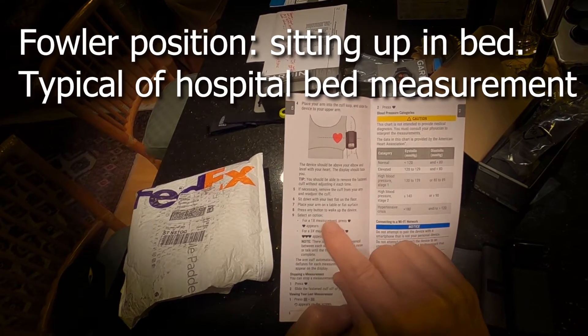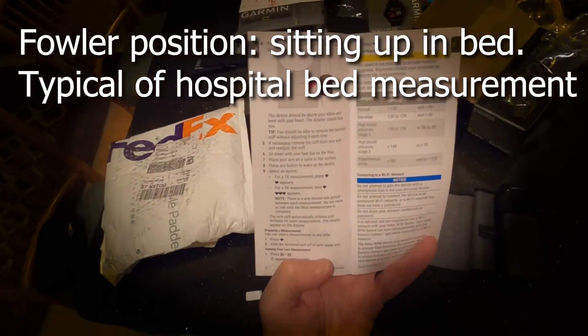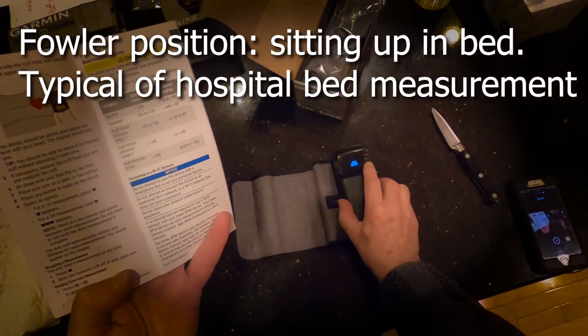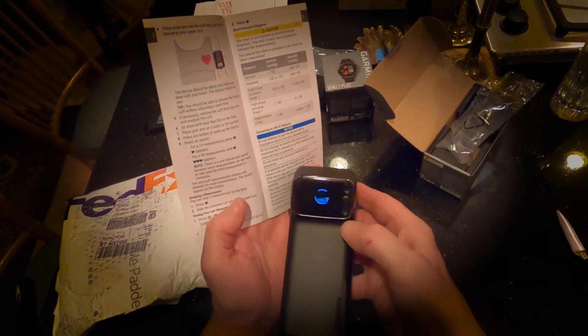Press any button to wake the device up, select an option. It says select an option, press any button, then it says select an option again. Well, where's the options?